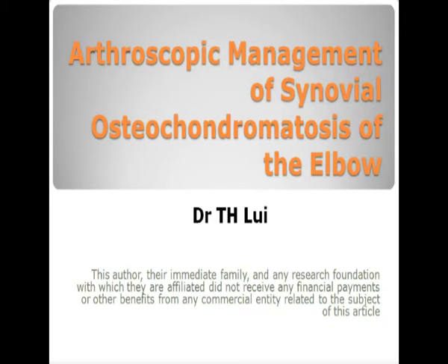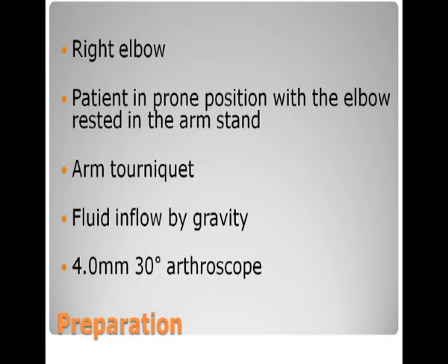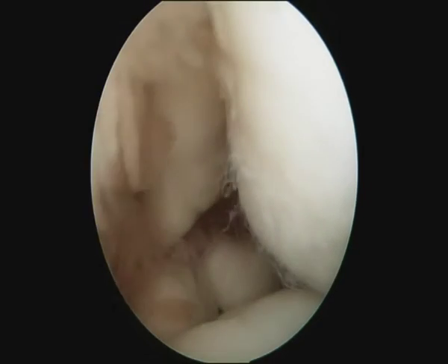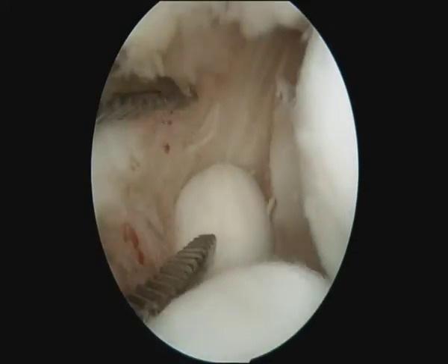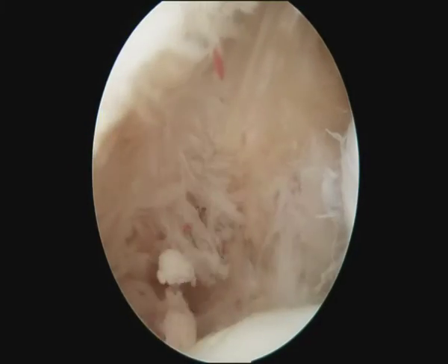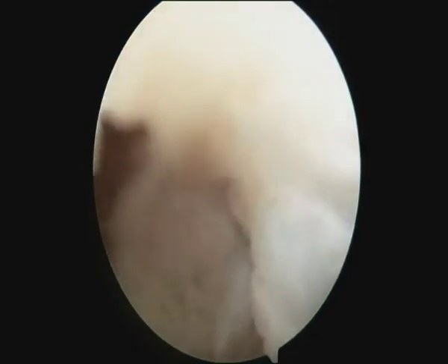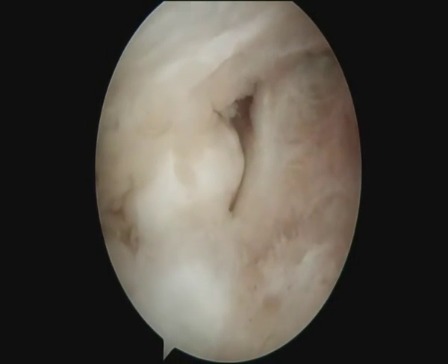Arthroscopic management of synovial osteochondromatosis of the elbow. For posterior compartment arthroscopy, the procedure is performed through the posterior lateral and posterior central portals. The loose bodies are removed, with small ones usually removed before the large one in order to avoid premature enlargement of the portal and excessive extravasation.